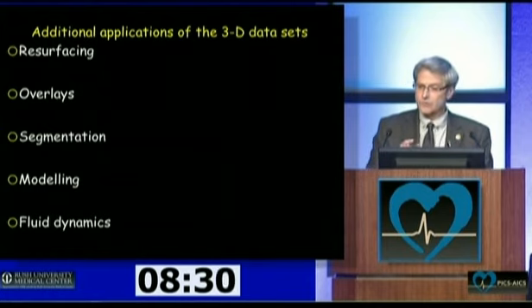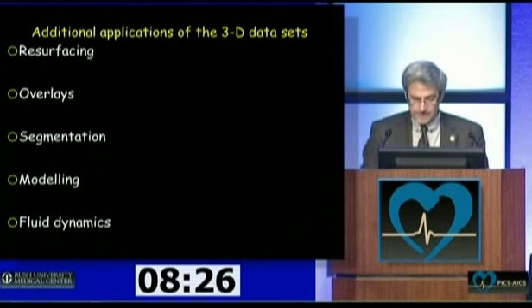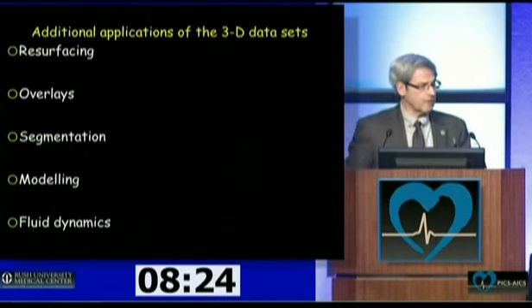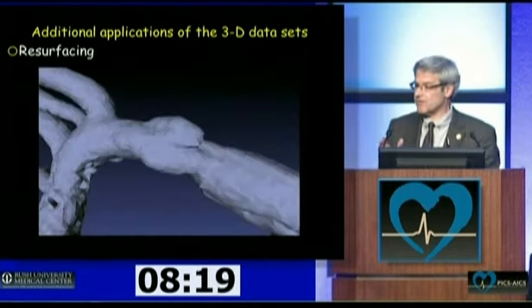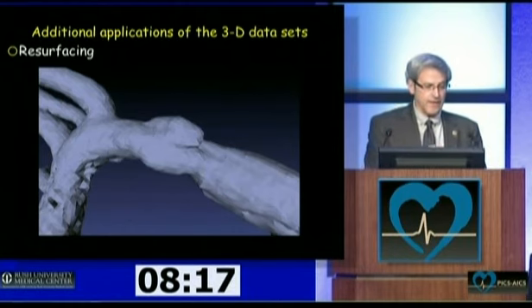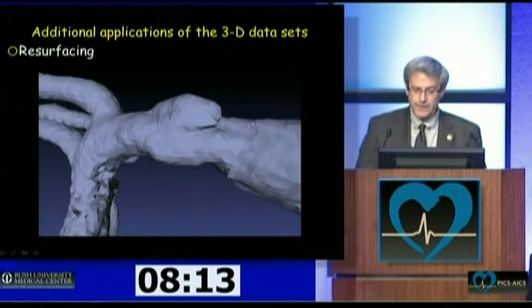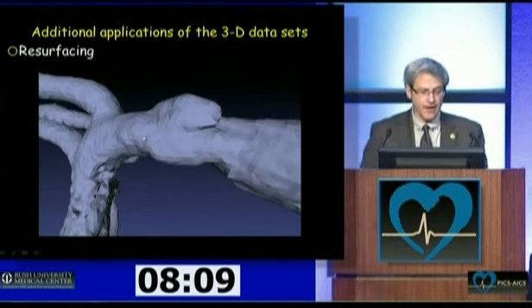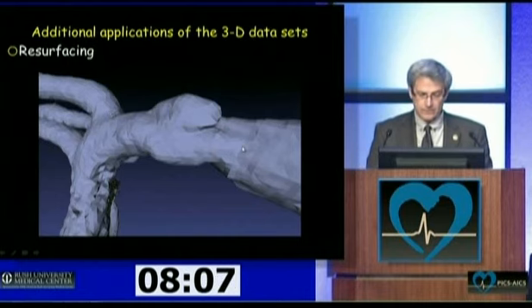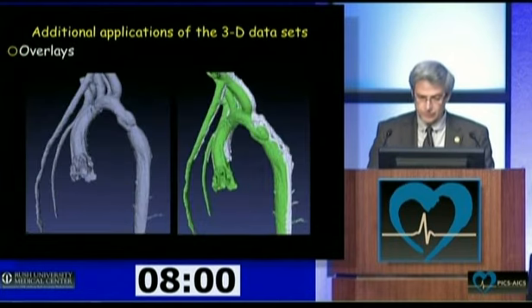So we also use the data set for other things, and I just wanted to show you some examples of resurfacing, overlay, segmentation, modeling, and then fluid dynamics. You can take the data set and reconstruct it and resurface the image so that you can get better information about diameters and dimensions and an understanding of how these things are oriented as you try to understand what you're actually doing.